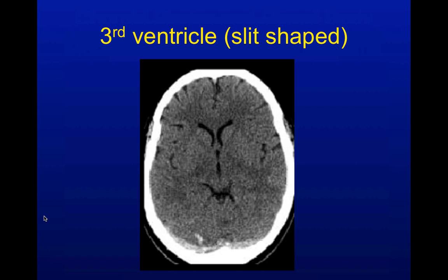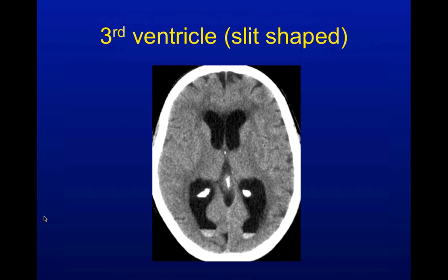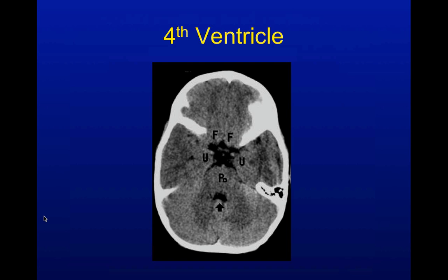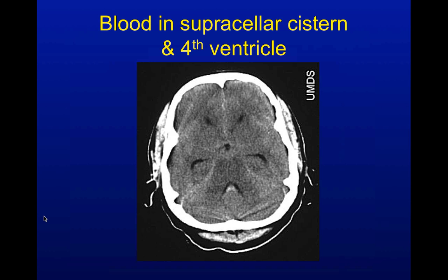The third ventricle is here in the center — kind of a keyhole slit, supposed to be nice and skinny, connecting the two lateral ventricles. That third ventricle is a little bigger than it ought to be — that's probably where they bled from, and it's layered out here on the posterior horns of the lateral ventricles. The fourth ventricle is down here, kind of helmet-shaped, as the CSF makes its way down toward the spinal cord. There's some blood down in the fourth ventricle. And where else do you see blood? The star — the supracellar cistern.